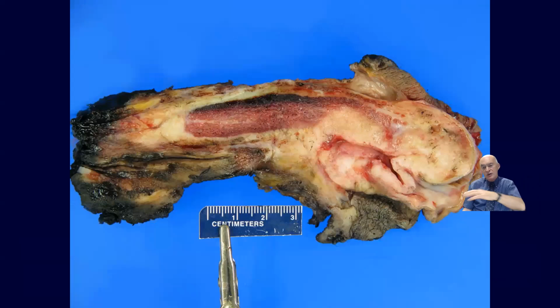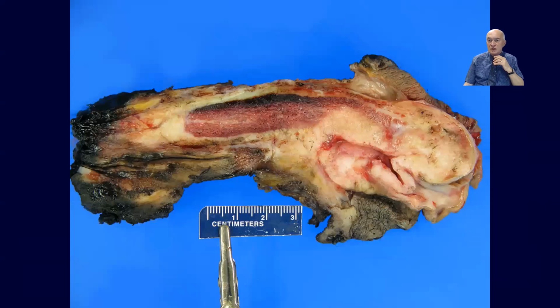And then when we dissect or do the cross-section, longitudinal section, as we've seen before, of the penile organ, you can establish a better correlation between the superficial tumor and the tumor that is deeper and even invading the urethral tissue. It seems that the tumor has grown in such a way in this particular case that it has occluded the normal urethra and has produced this fistula at the base of the penile organ. So here we have a nice margin that we need to sample, and also sample at different levels to be able to identify the presence of tumor in relationship with the different layers of the penile organ.